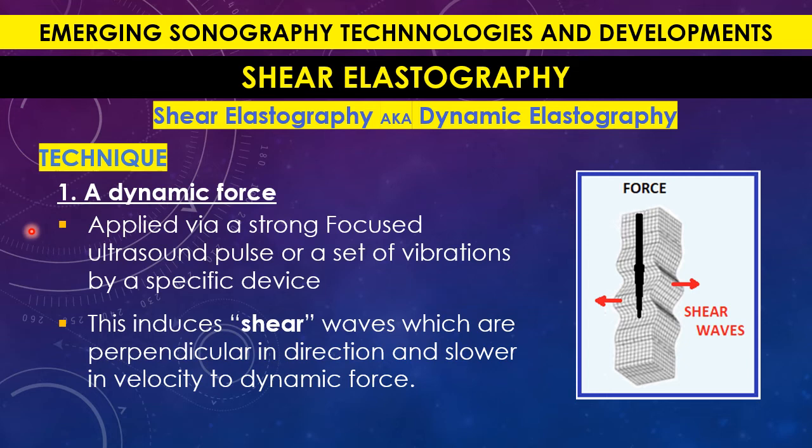We call it static because it's manually applied, but here it's dynamic force, and that's why another synonym for the shear elastography is dynamic elastography. Why? Because the force here is different. What is this force? It's one of two things. The ultrasound probe in this system is the main source of this dynamic force.